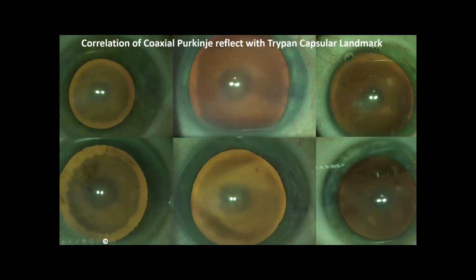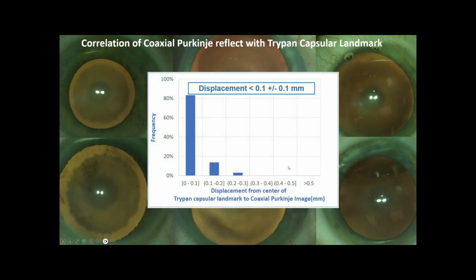We basically see wonderful correlation between the Purkinje images and the Trypan landmark. Now, in the statistics, and for an anatomical system, this is a very significant correlation.